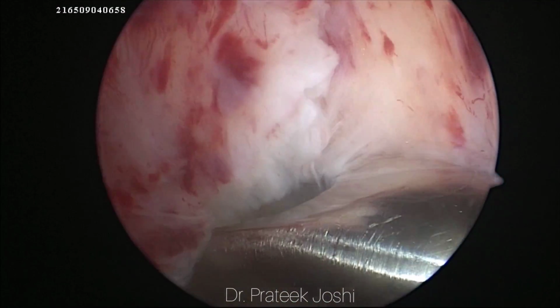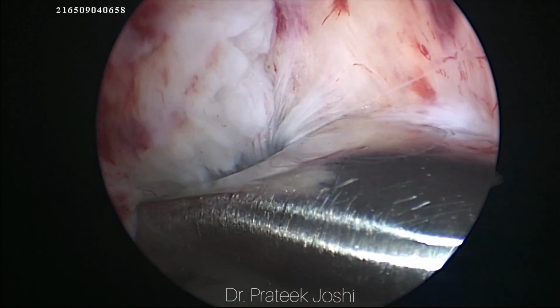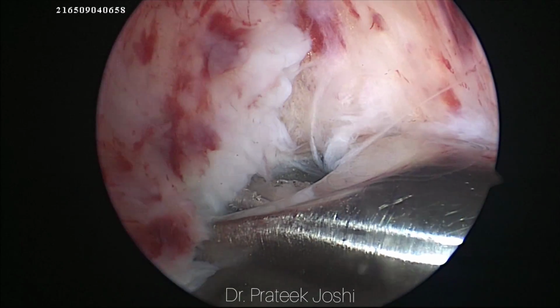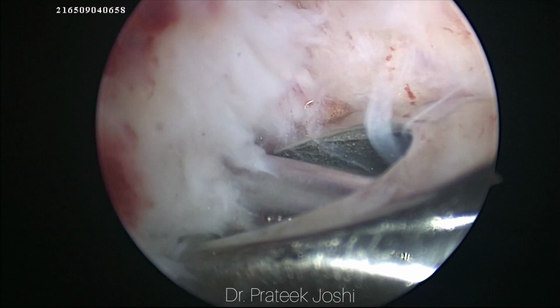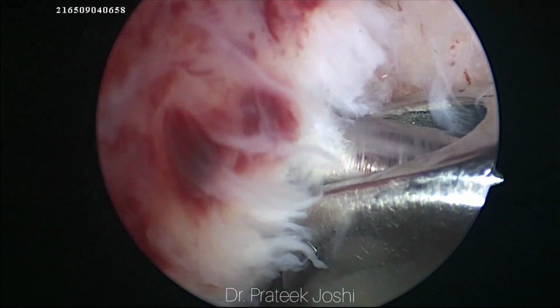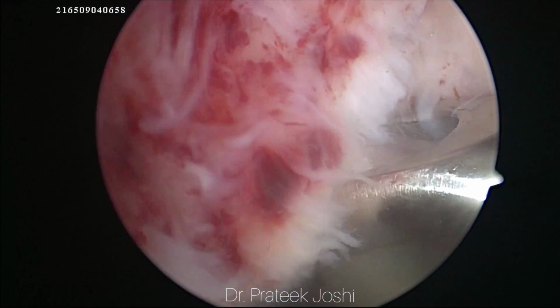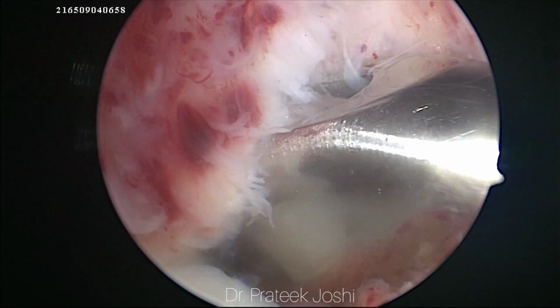Many years back, ACL reconstruction was being done by the transtibial technique, in which the femoral tunnel was drilled through the tibial tunnel. So essentially both tibial and femoral tunnels were in one line. The disadvantage of this technique used to be reduced rotational stability many times and non-anatomical ACL tunnel placement sometimes.